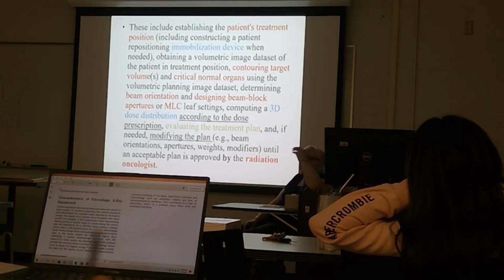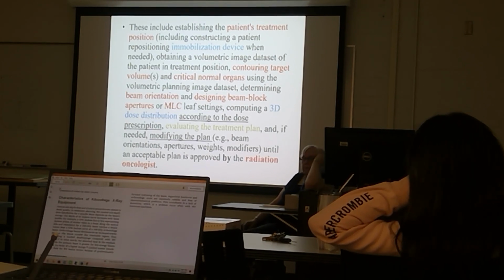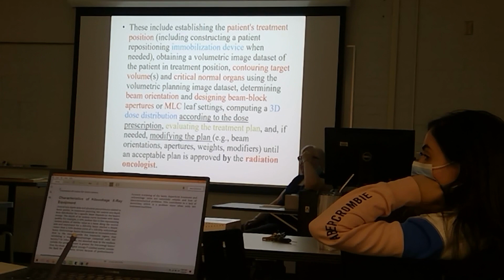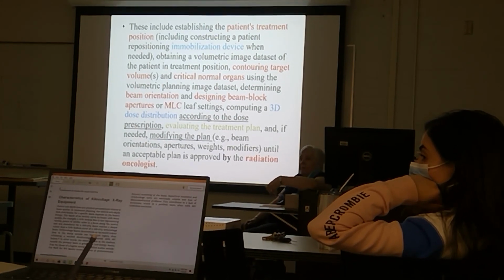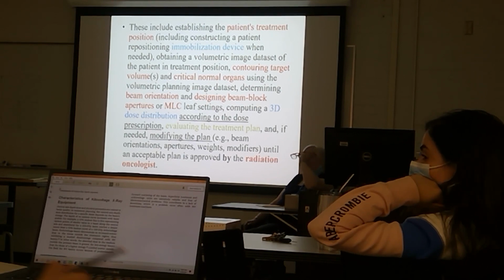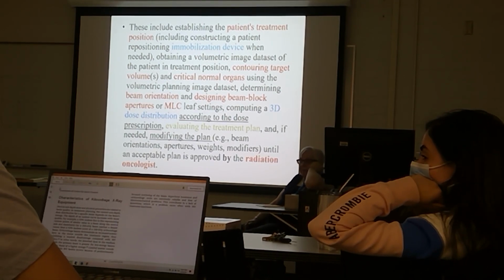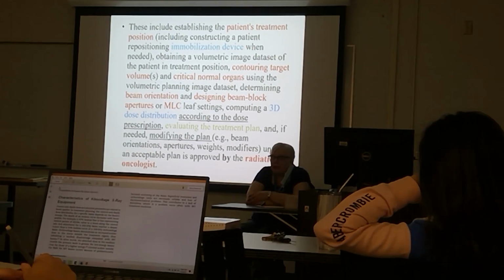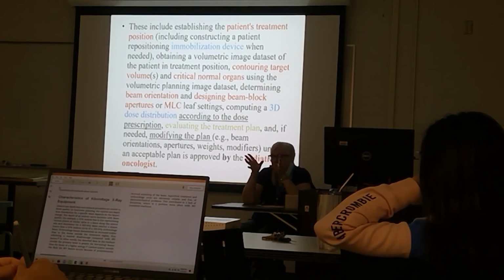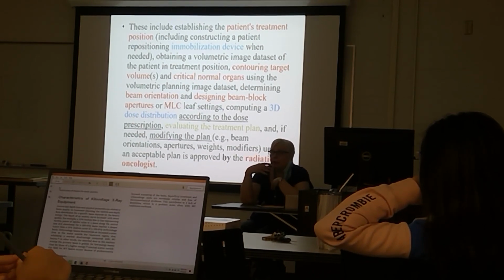We have a breast patient that uses bolus every other day, but instead of traditional bolus, they just use wet towels. Have you heard that? Oh, yeah. She's a bigger patient and it kind of dips, so they have a hard time. Water is tissue equivalent, soft tissue equivalent.